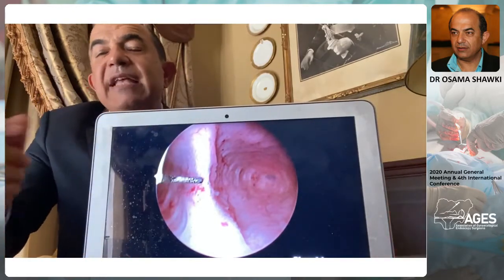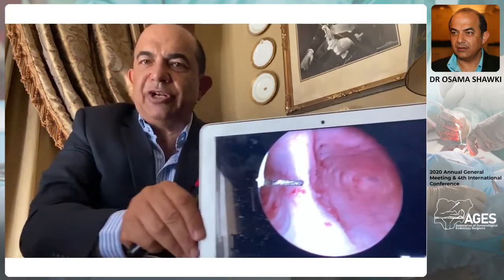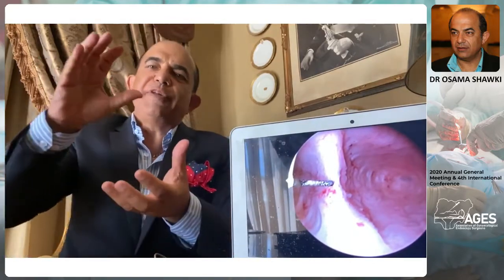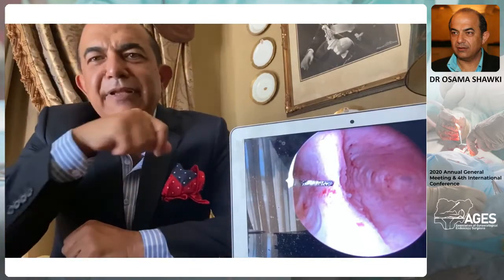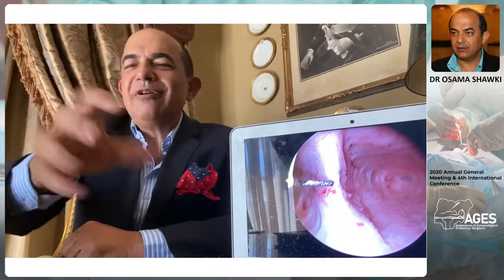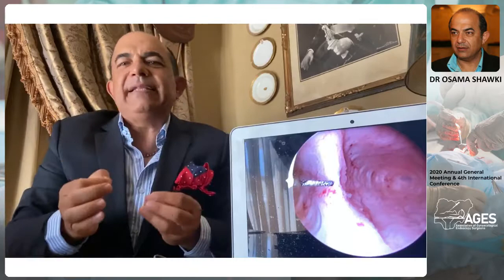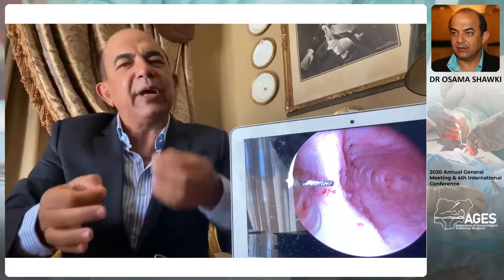How to achieve this stretch of the septum? Definitely by proper intrauterine distension. Forget about the word pressure, call it intrauterine distension, which depends on the inflow, outflow. By the way, let me tell you, one of the very big secrets of a good hysteroscopist is not how you move the equipment or the tools at all. It is your ability to calibrate and adjust the inflow and outflow.